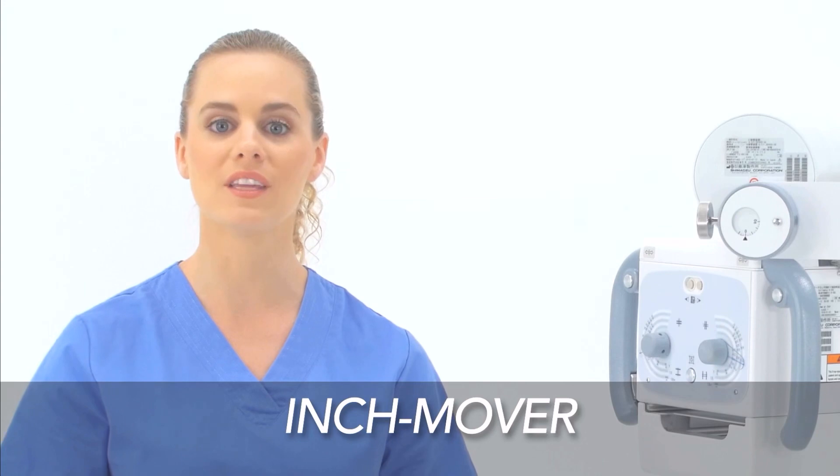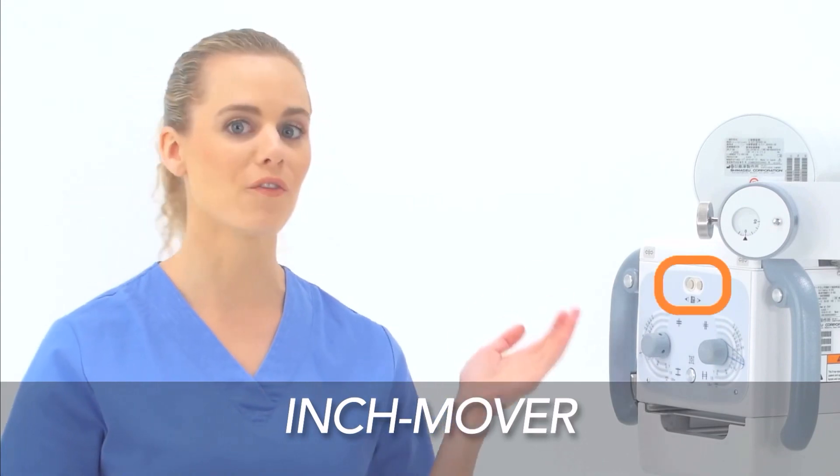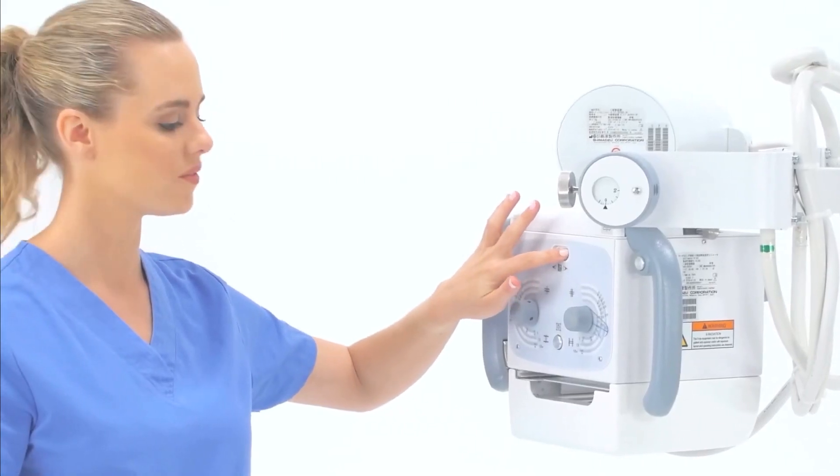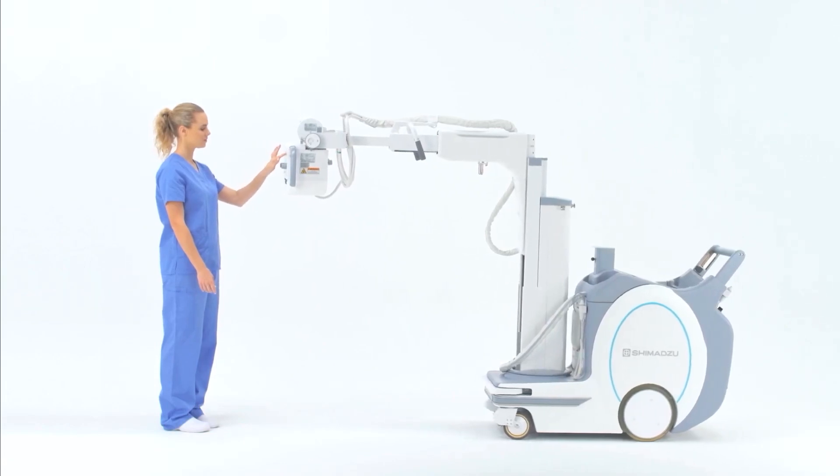If you find yourself in a tight area and need to move the MX-8 mobile system a few inches forward or backward, there is a feature you can use called the inch mover. Located on the front face of the collimator, inch mover allows you to move the portable a few inches forward or backward without having to return to the drive handle.